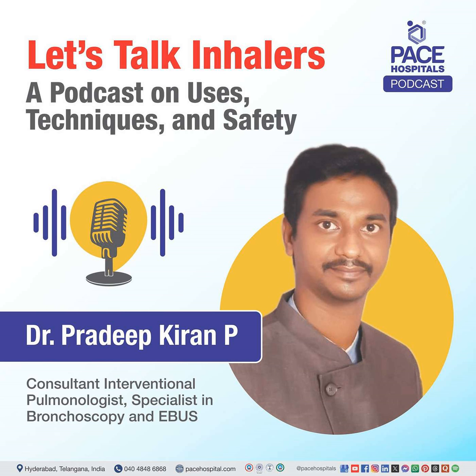So, doctor, can you explain the different types of inhalers and what makes each one unique? So there are various types of inhalers, out of which the most commonly used are metered dose inhalers, which are commonly called MDI, and DPI, dry powder inhalers. These are the two basic inhalers. There are many more updates in these inhalers, such as Accuhalers, breath synchronizing inhalers. So many things are there, but once you know how to use these two basic inhalers, the rest of them will be very easy.